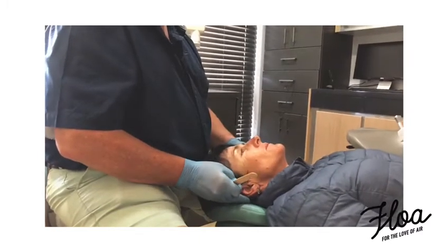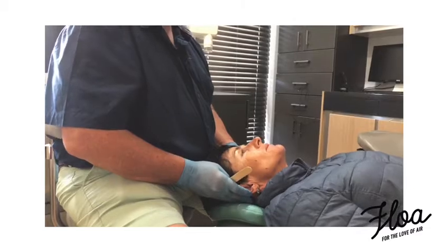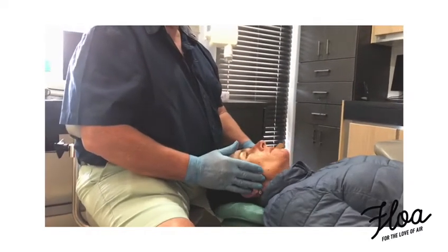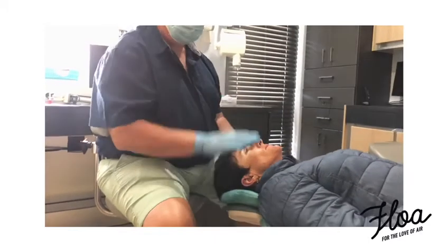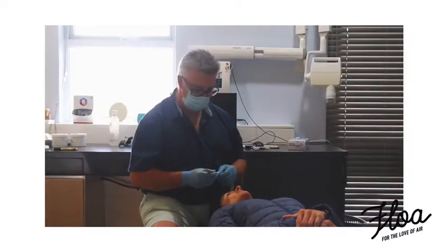The first thing we're going to do is ask Michelle to give us a nice snore. She's lying flat on her back. Please remember that you can't do this in a semi-upright position or a normal dental working position — you want your patient as far back as you can, quite probably even a little bit lower than this. They've got to be flat.